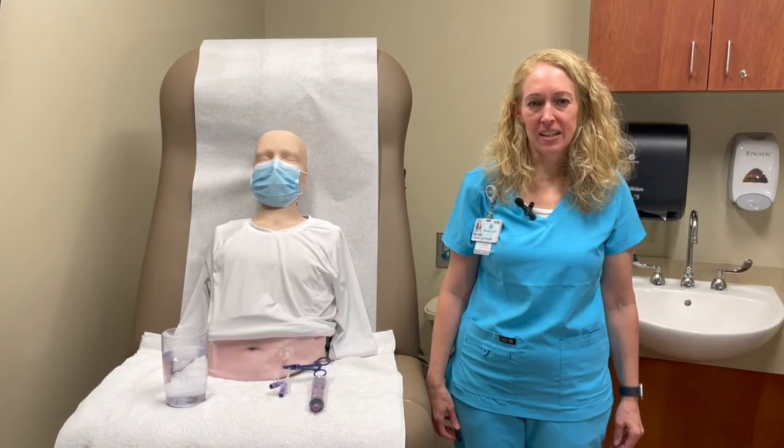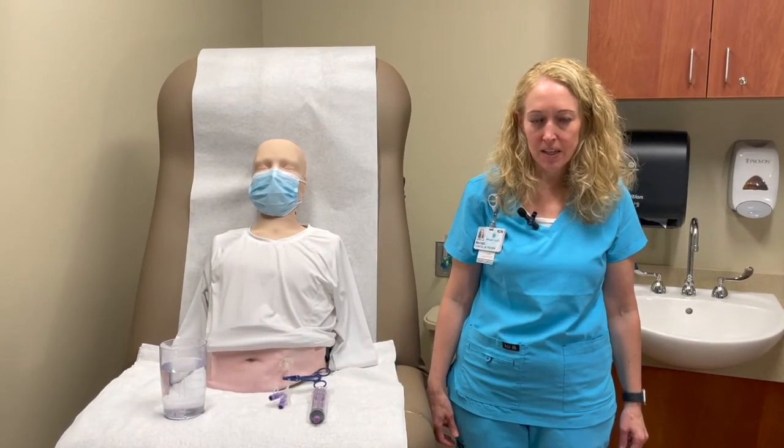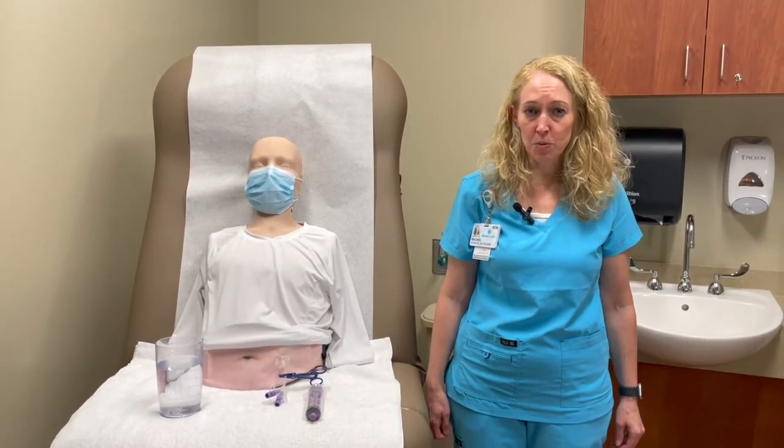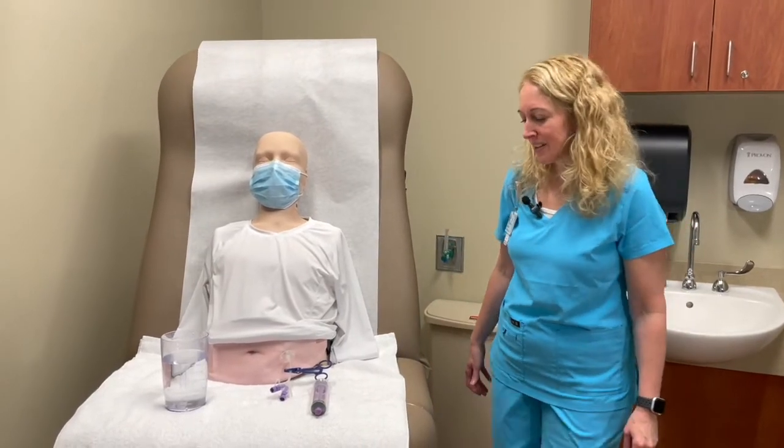Hi, I'm Rachel, a registered dietitian at Levine Cancer Institute, and today we will talk about water flushes through the feeding tube. If you're looking to do water flushes with a gravity bag, check out my other video. So let's get started.